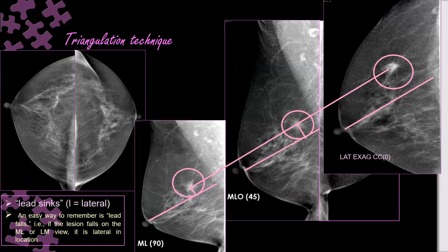Yes, I wanted to say that from the beginning. I'll tell you something. In the previous cases we discussed, the lesion usually projects over the pectoralis, extreme posterior, or posterior and superior toward the axillary tail or parenchymal apex. All these locations point toward the upper outer quadrant.